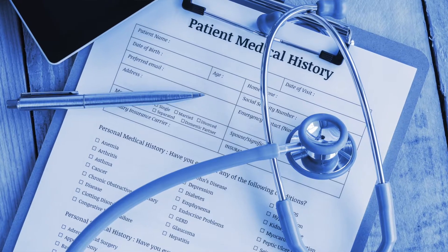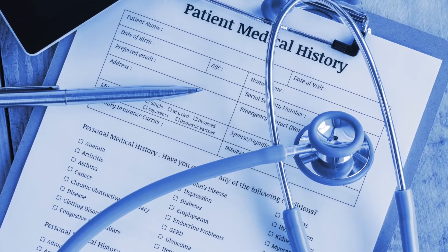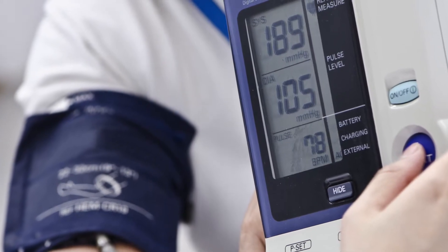You may be asking what this means for us as dental providers. As dental providers, we should always ensure that our patients are safe to treat. We should also look for anything that may require us to modify our actual treatment for that patient, and we should always be screening our patients for underlying medical issues and make the appropriate referral to their physician when necessary.